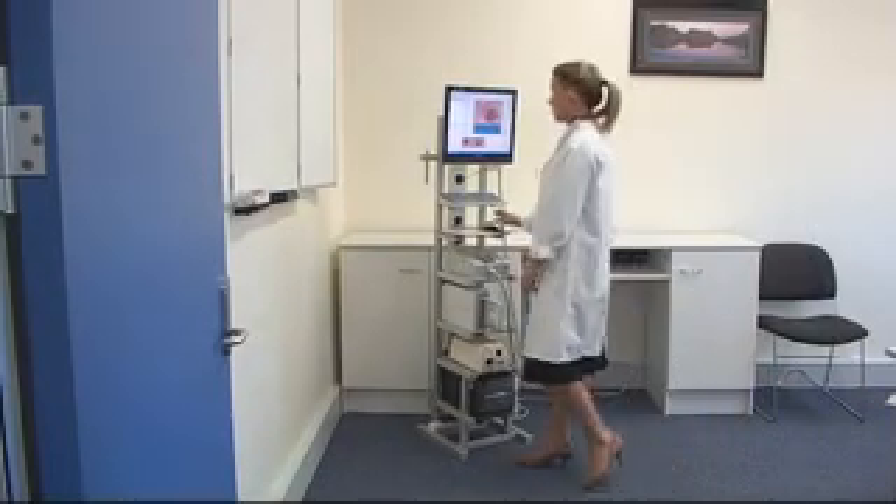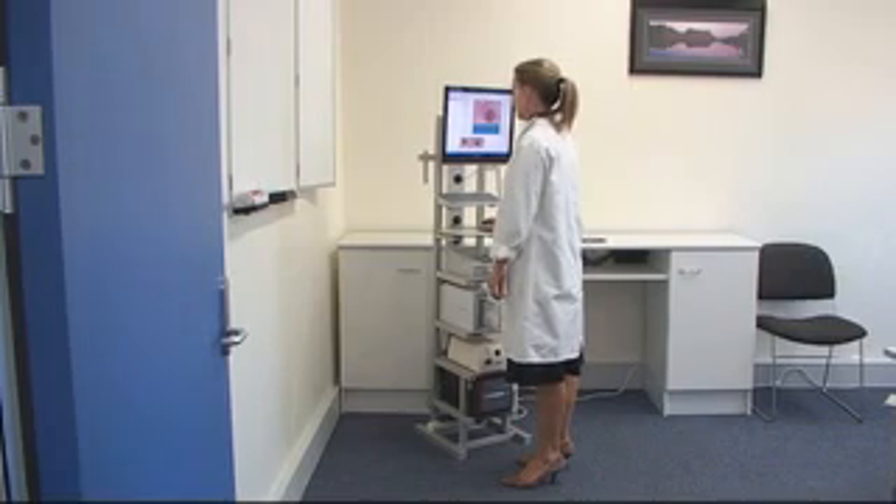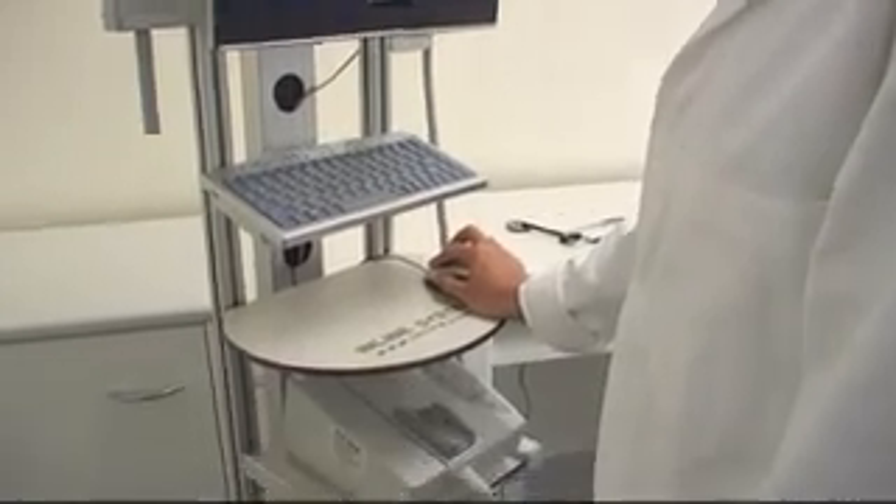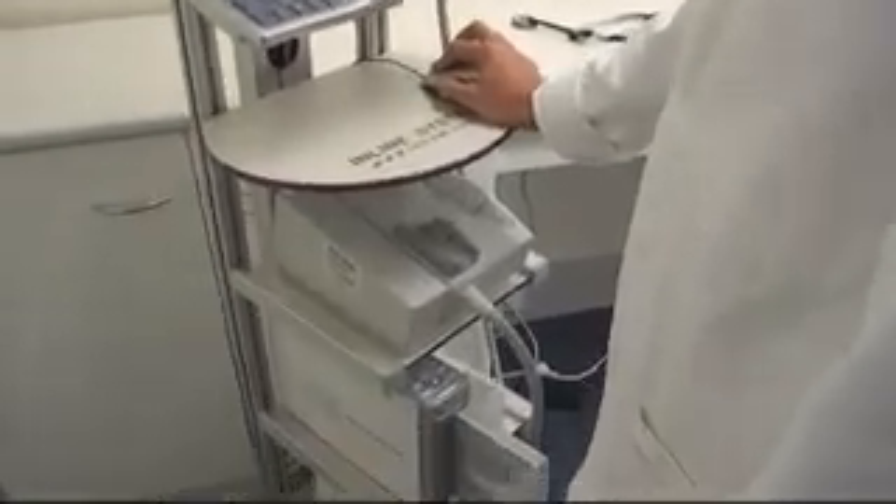The Microvision can also be connected to a PC for direct image archiving over a network, as seen on this slimline equipment stand. Equipment includes a flat screen multimedia monitor, keyboard, mouse, photo printer, along with a high performance PC.